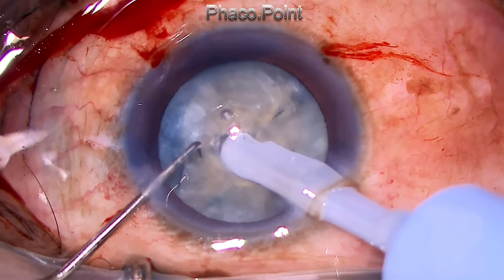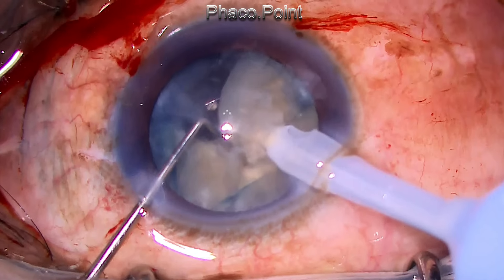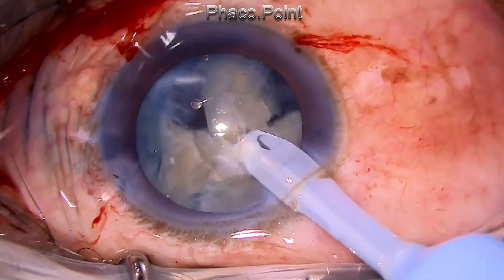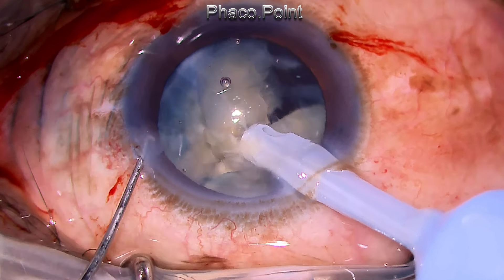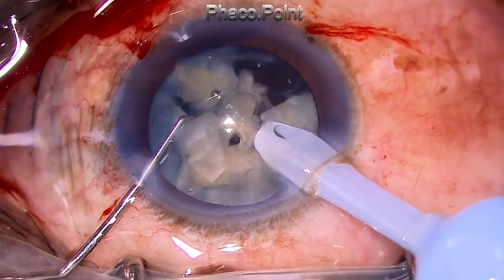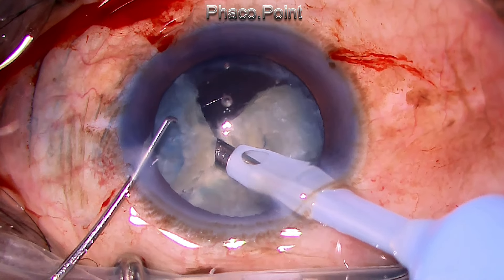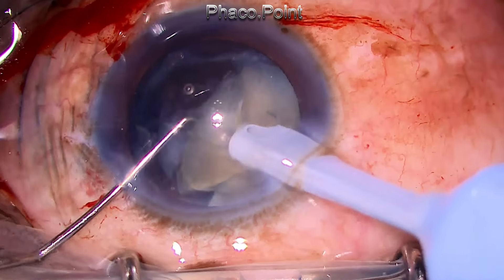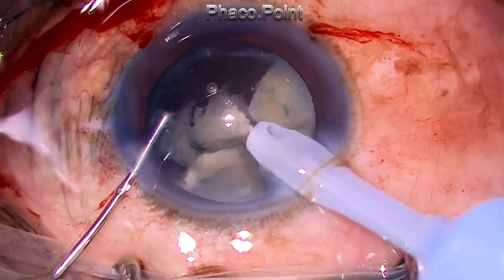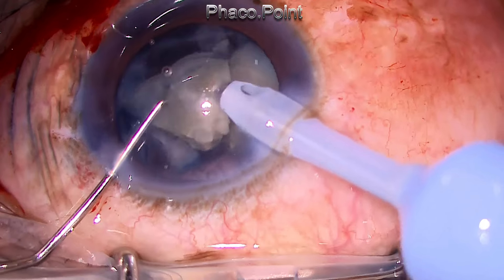The reason why you can choose a direct chop is that the vacuum will impale and lollipop the nucleus, and slightly lift it off from the posterior capsule, which means that there are no positive forces transmitted to the posterior capsule, and therefore it is quite safe. You can see that in spite of having a rhexis runoff, I am breaking the nucleus within the capsular bag and mobilising only one piece at a time, because it simply will not do to get the entire lens out of the capsular bag and do emulsification in the anterior chamber — you will have a cornea that looks as white as this cataract in the post-operative period.